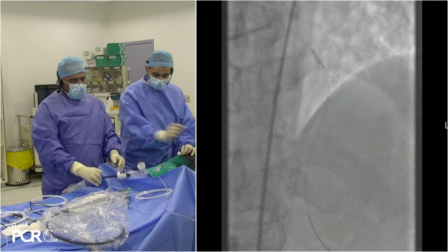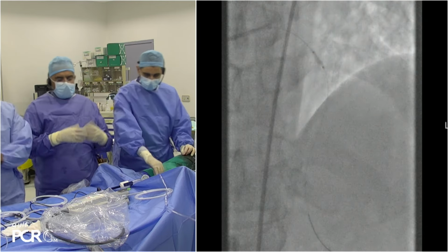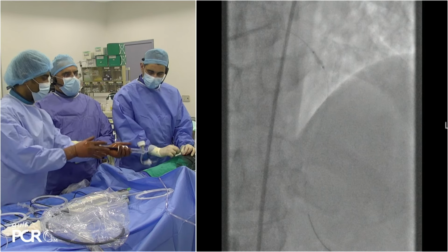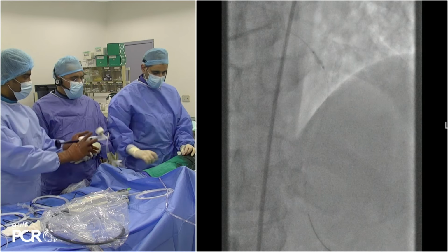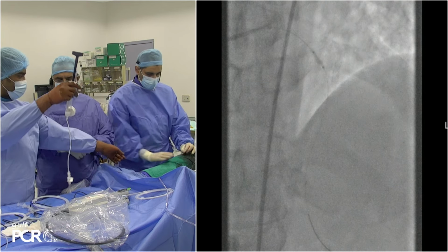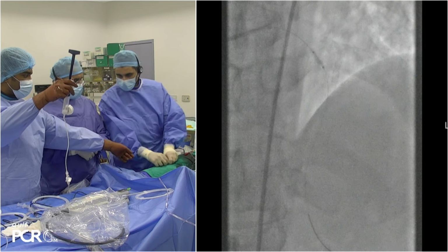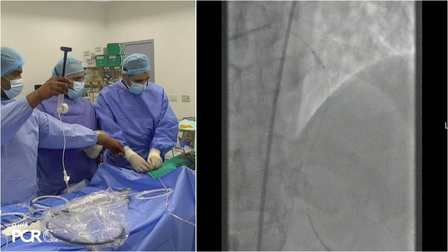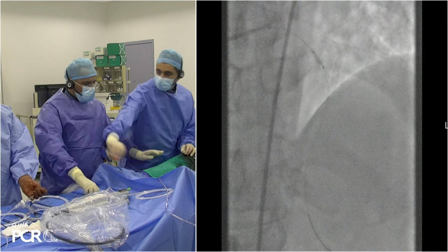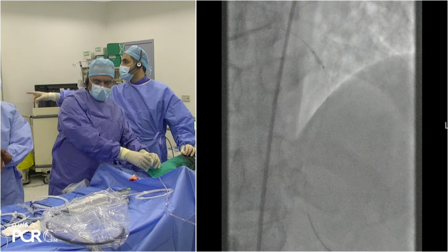I think what we look for is the balloon opening. The haziness, I think it will stay there because most of the calcium is there. But you can see the cutting balloon has been opened. Get us an NC balloon, 2.5. Now we did the cutting balloon. Now we'll do an NC balloon. And then we'll do another run of OCT.